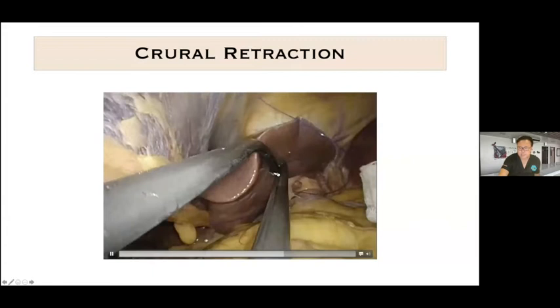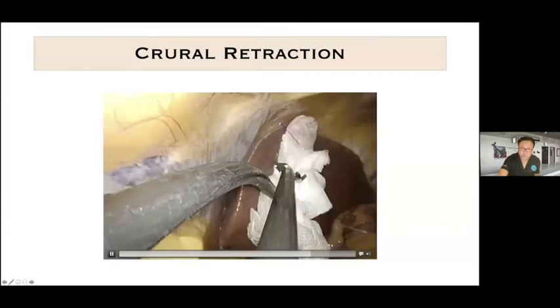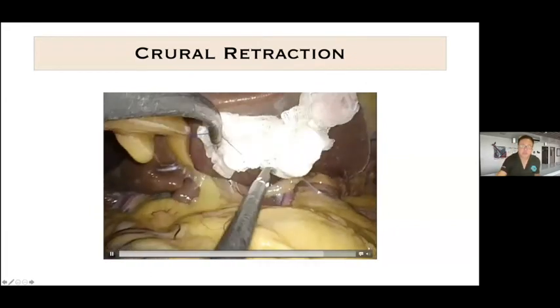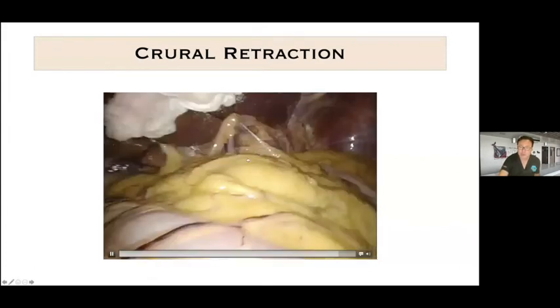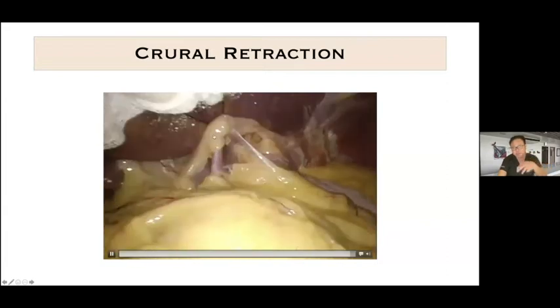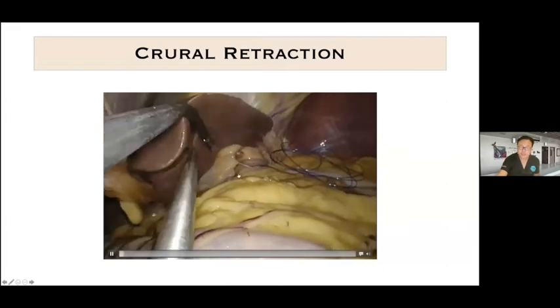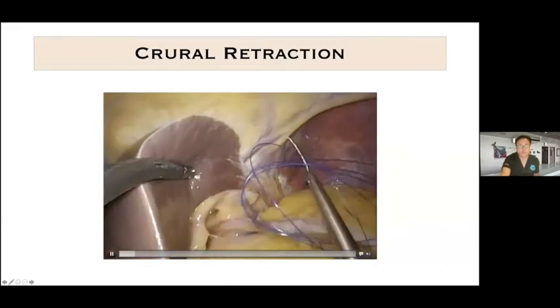The other simpler one actually to be able to retract the liver is to pass through an epigastric port, in a trocar, a 5 millimeter grasper. You can grasp your crural area and lock it up. Once you've locked that instrument, you'll have now an effective retraction of that liver going upwards just by the usage of your simple laparoscopic instrument.